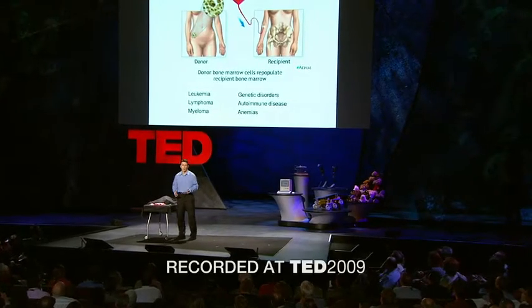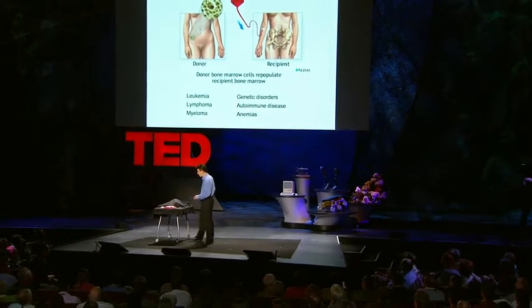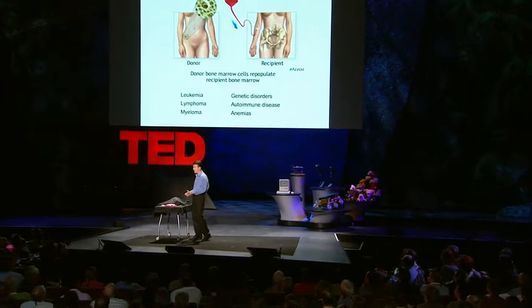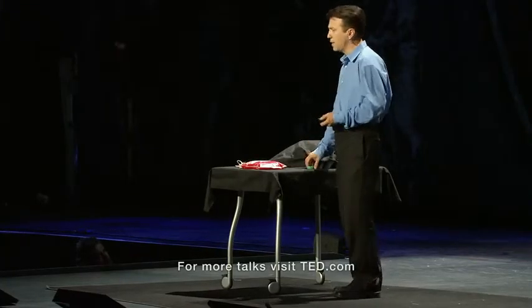So a few years ago, I'm doing my transplant fellowship at Stanford. I'm in the operating room. We have Bob here, who's a volunteer donor. We're sending his marrow across the country to save the life of a child with leukemia. And so actually, how do we harvest this bone marrow?